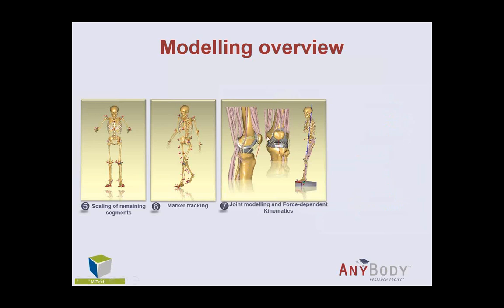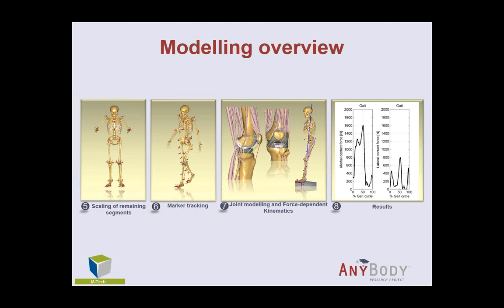We introduced both contacts between the components of the total knee replacement, and we also introduced ligaments as well as we could. And then we used a method called force-dependent kinematics to resolve both the internal forces and also movement within the joint, and also muscle forces and so on. But I'll explain that in the next slide, how we did this.